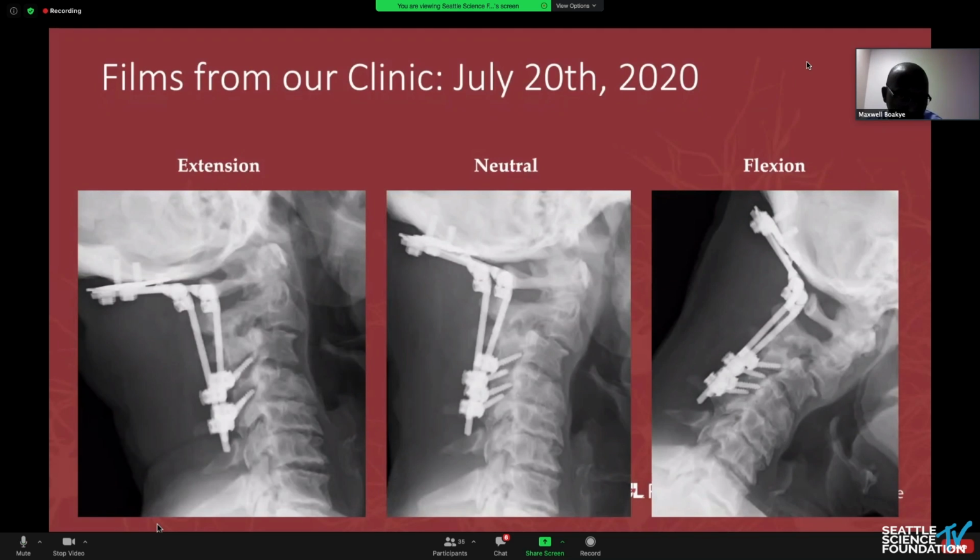Yeah, my thoughts were to do like a 540 procedure. First, take out the hardware, and if there are any fused segments from the back, release those, then come back anterior. So when you take out the hardware, try to get screws in C1, possibly C2 and 3, and then come back anterior, put in the grafts, and then go back and put in a rod. But go back to maybe C1, depending on whether you could get good fixation in C2 and C3 anteriorly. Maybe stop at C1, not go back to the occiput.